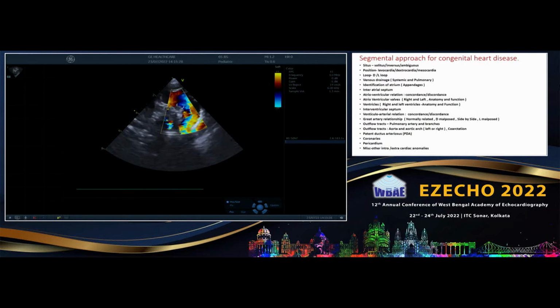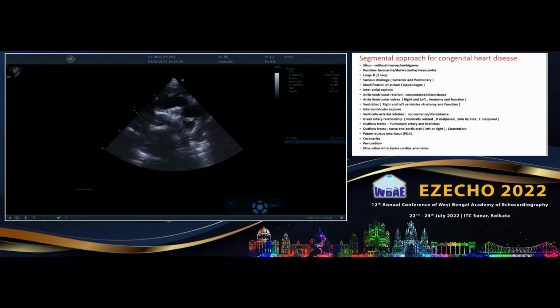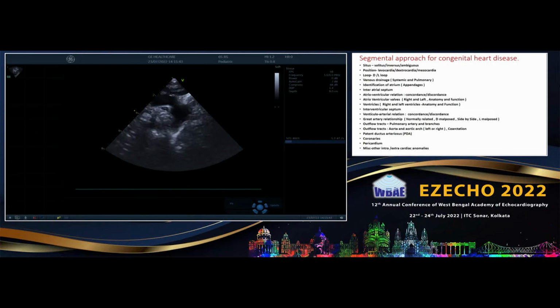And the second, the branch pattern of the arch, coarctation, and then if we go more, the aberrant subclavians. If you can show the branching pattern of the first artery going up, if you can show it in the short axis. So this is the suprasternal long axis, and then in short axis we'll see the aorta round. Go to the suprasternal and show, a little bit up. Yes, she's showing it. So it is the aorta in short axis.